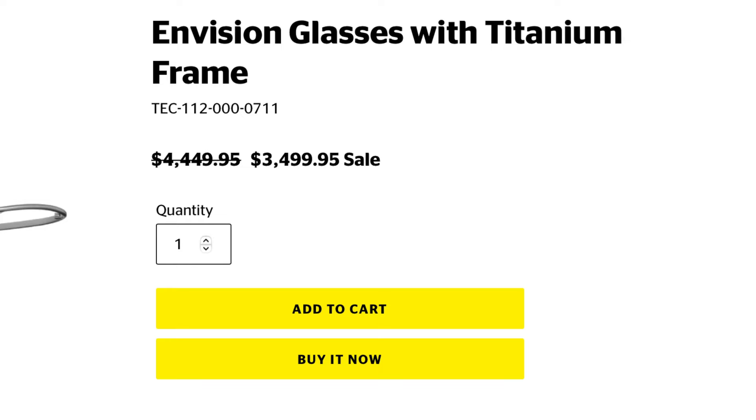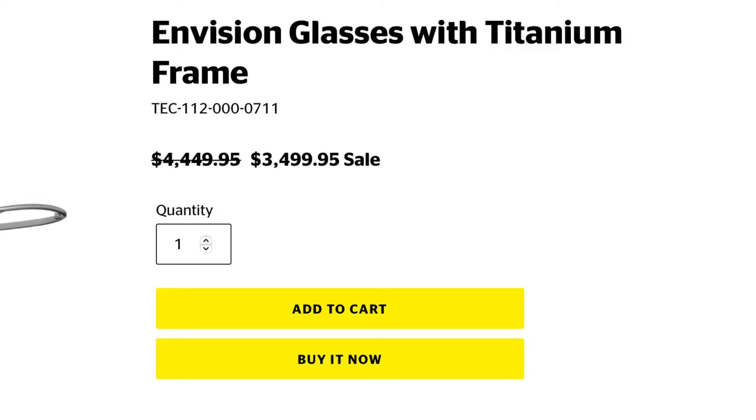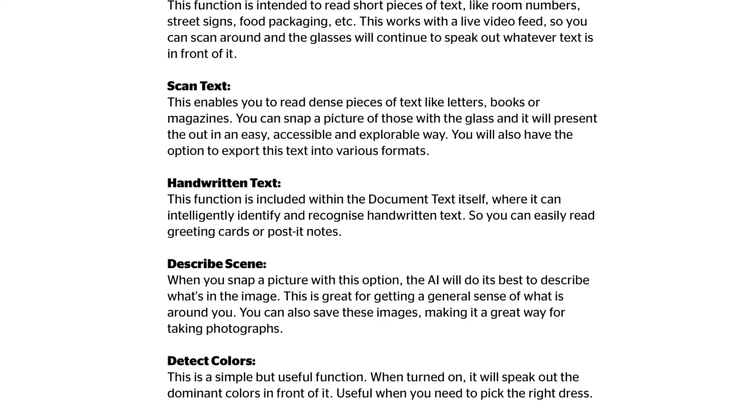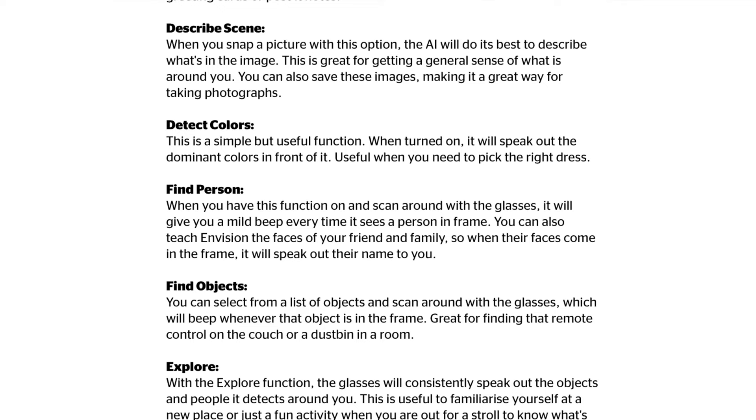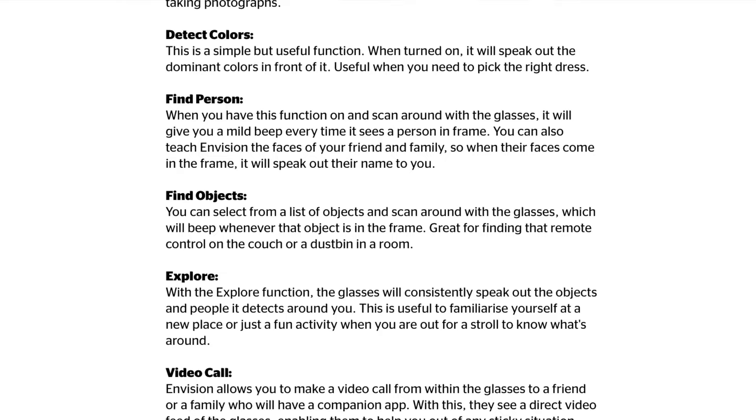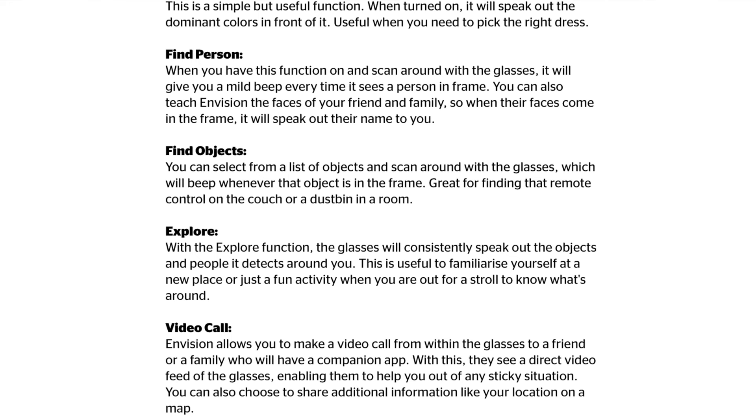At the time of filming, Envision costs $4,500. However, there are frequently discounts available, so watch for those. It comes with an additional phone app, following a subscription-based model of $20 per year or $99 for a lifetime — and if you purchase the Envision glasses, the subscription is included. It has a battery that lasts five to six hours of normal use, an 8-megapixel camera, charges with USB-C, fast charges to 50% within 30 minutes, and weighs around 50 grams. Features include colour detection, currency detection, scene description, face recognition, instant text, scan or batch text, voice commands, object locating, calling via Aira or an ally contact, multiple language options, handwriting reading, and a light detector.